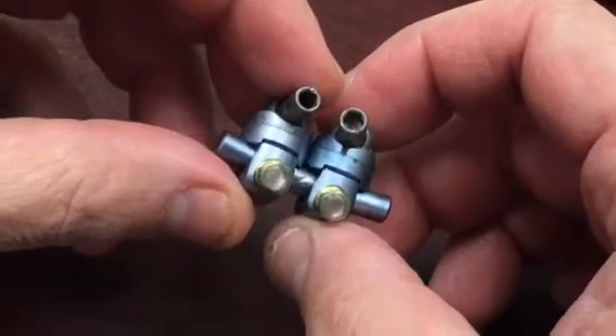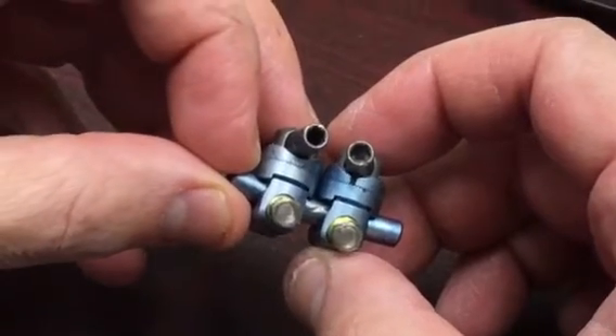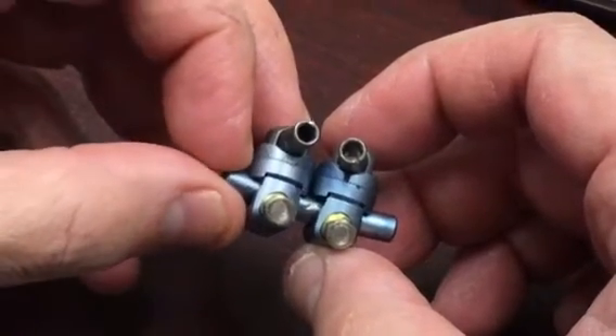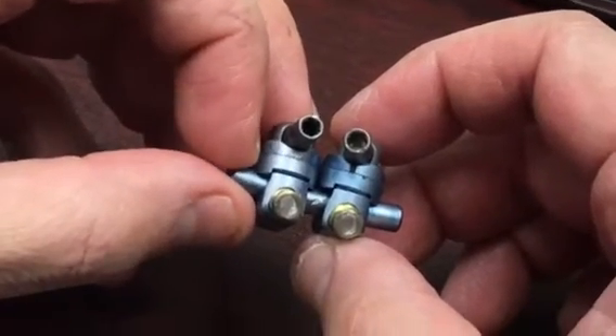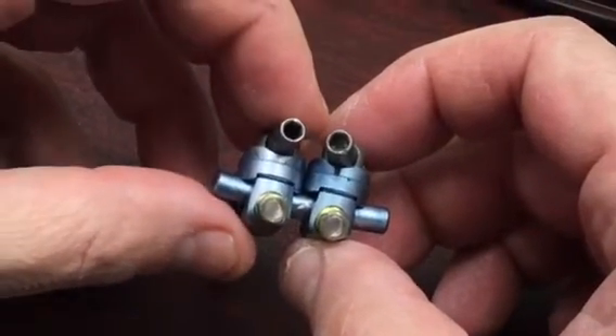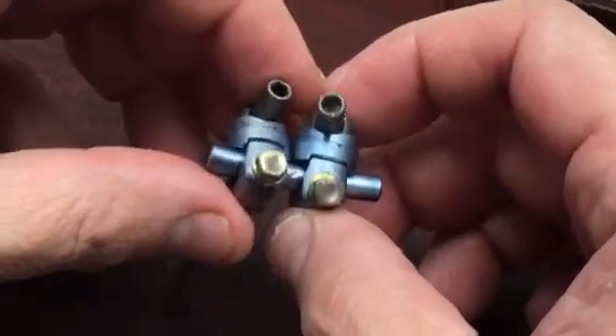In this video we're going to go over removal of the TSRH 3D system. The TSRH — Texas Scottish Rite Hospital three-dimensional system — was made by, and I think it's still made by, Medtronic Sofamor Danek system. So this is it.